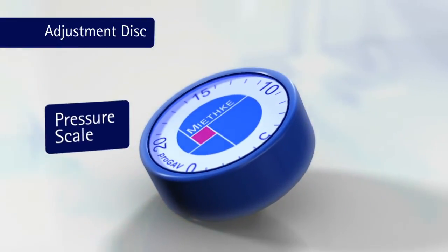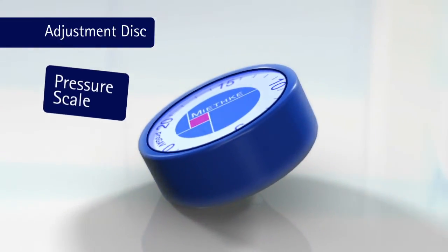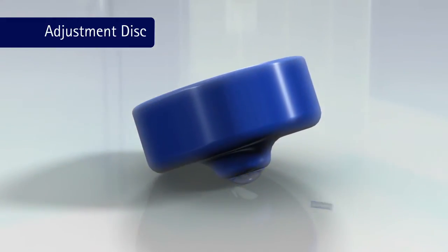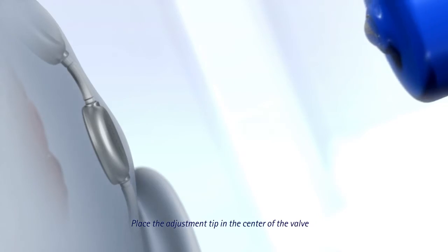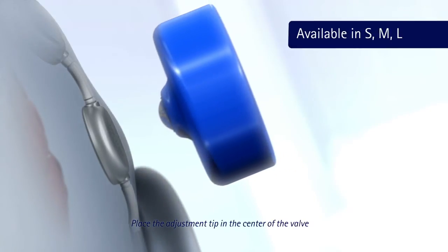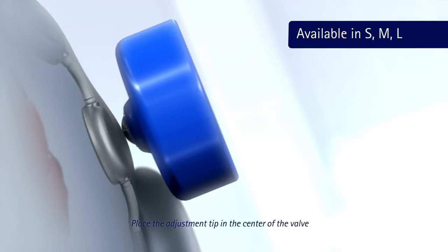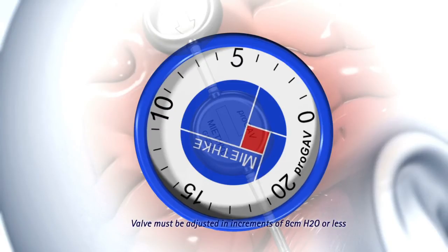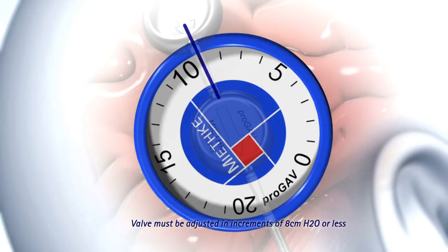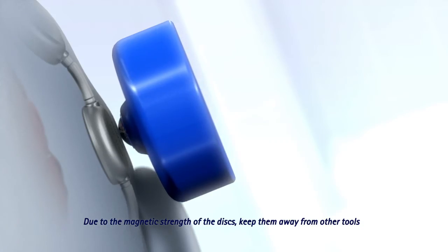An additional method of adjustment in patients with edema, scarring, or thicker skin can be performed using an adjustment disc. Select the appropriate adjustment disc based on the amount of swelling, edema, or skin thickness. Place the adjustment tip in the center of the valve, aligning the desired pressure with the inlet connector. Depress slowly and then release.